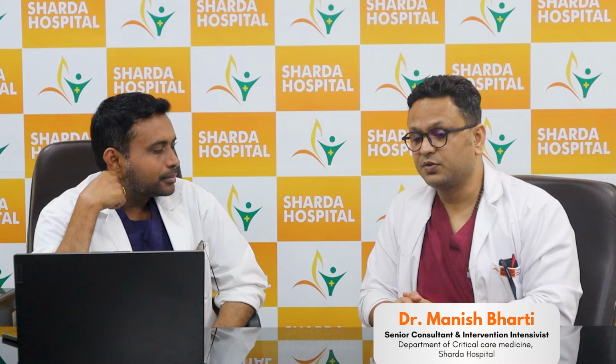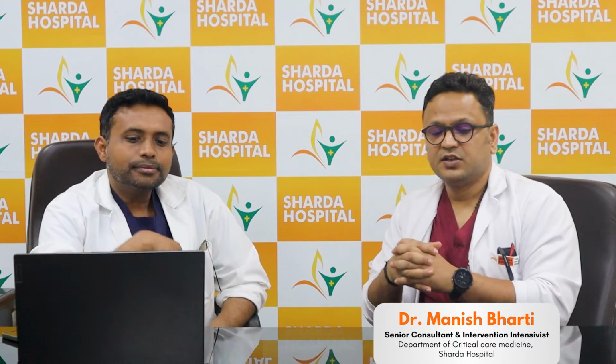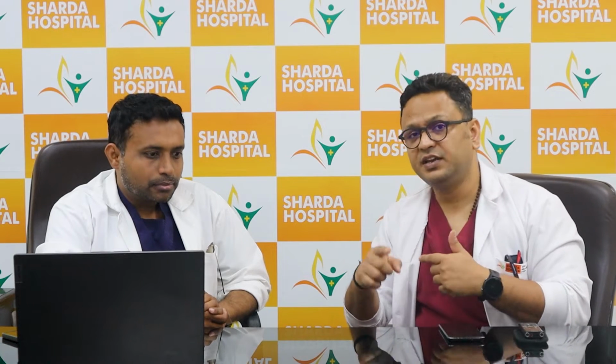I believe so because whenever you have any idea, you must know the reason behind that idea. So in order to initiate the bronchoscopy, first and foremost, there has to be an indication. You must justify the indications. You're not going to use a bronchoscopy for every second patient, but at the same time, for every patient in the ICU who needs a lot of inputs in terms of ventilation, antibiotics, and all those kinds of things, at least you should think, can I have a better diagnostic yield? Those kinds of questions should be in your mind. So first and foremost, there has to be an indication.